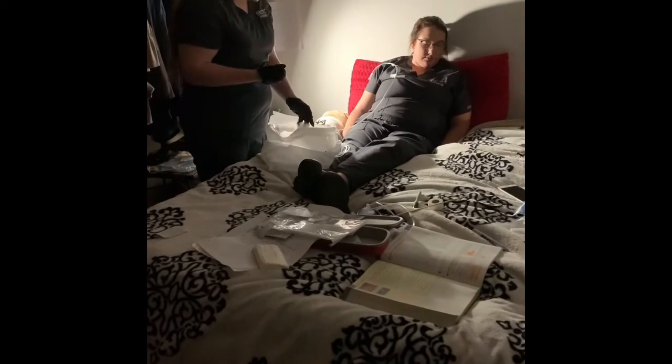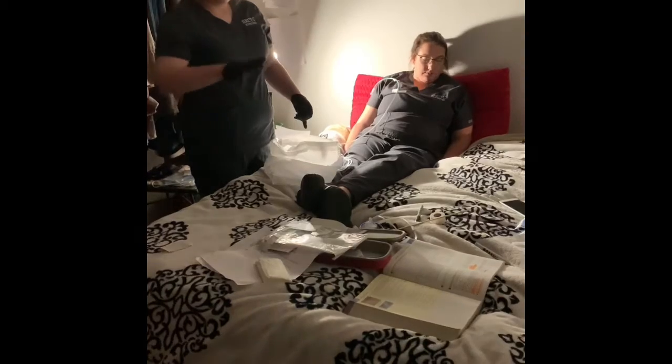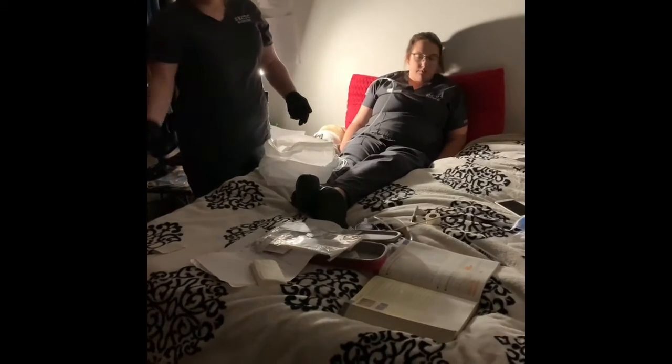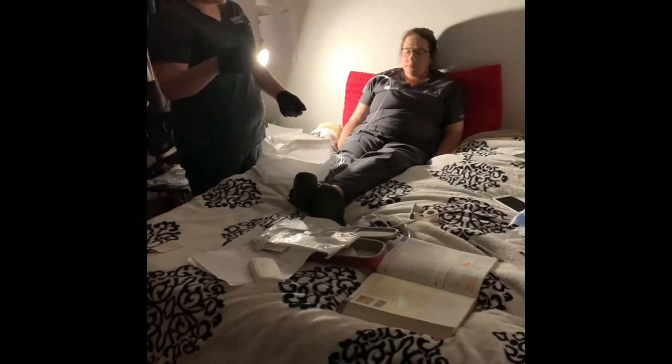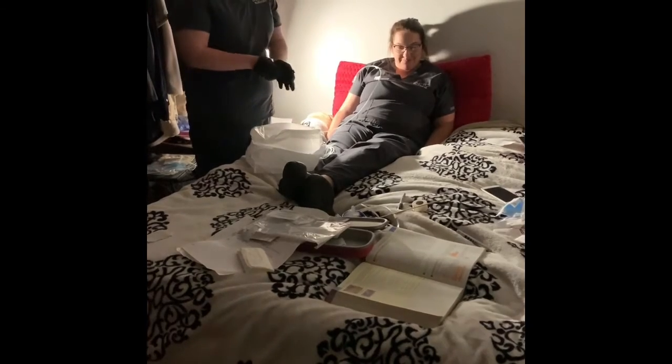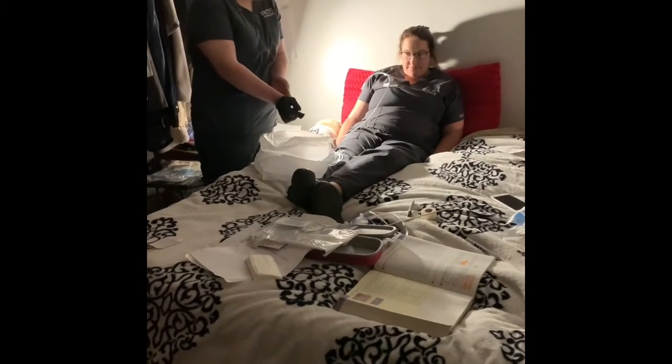Once the bandage has been removed, I would then put it in here. I would assess for drainage, any kind of leakage, any kind of blood, any kind of redness, swelling, anything that shouldn't be there. And if there was, I would put that in the documentation. And if there isn't, in this case, I'm going to continue on. I would remove my gloves.